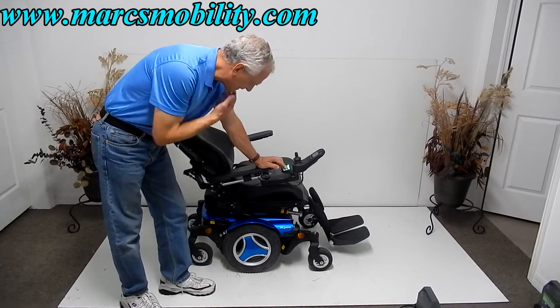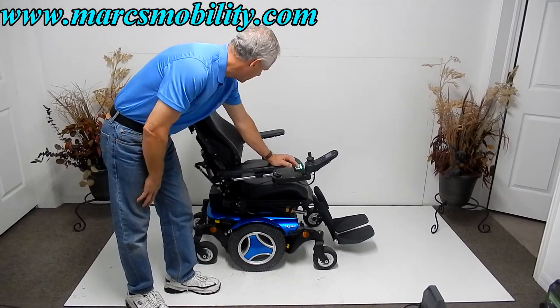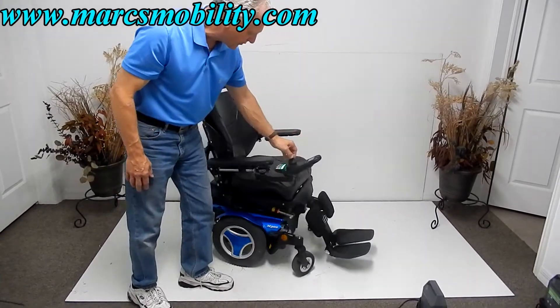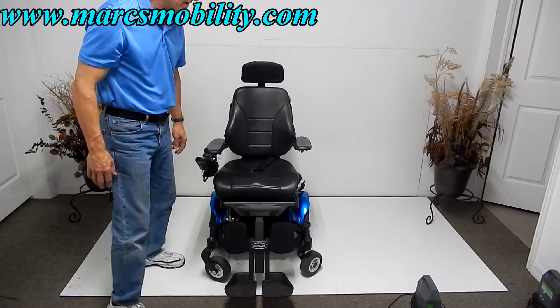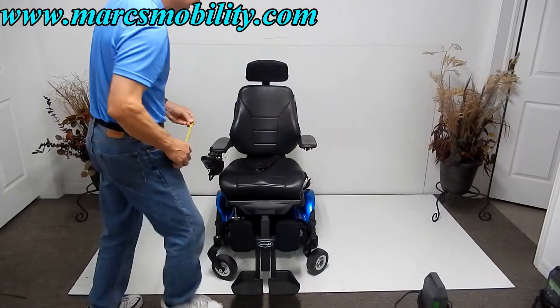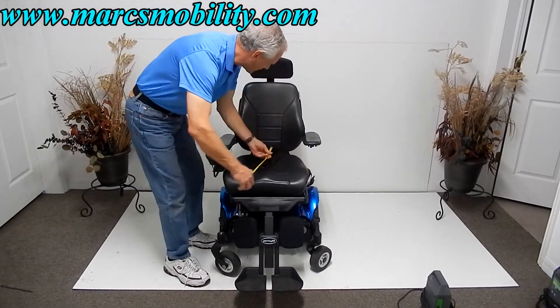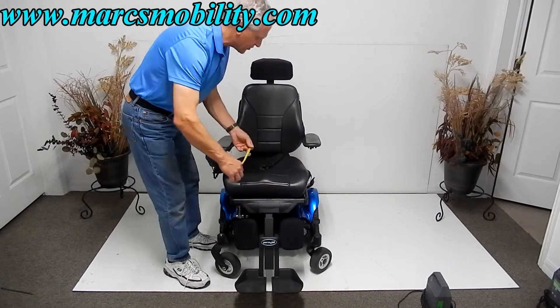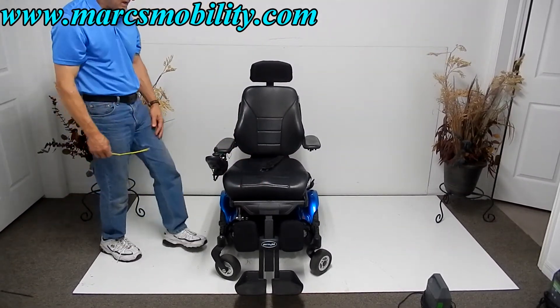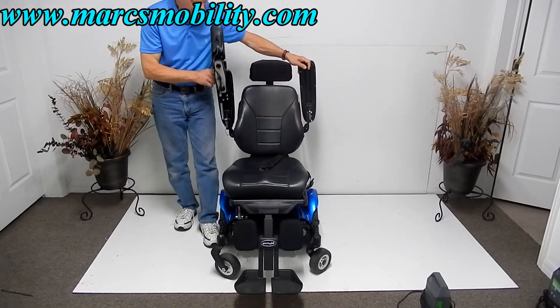The joystick is a swing-away joystick. The arms are adjustable up and down — we can adjust these arms. The seat is also adjustable on this chair. The seat right now is 19 inches wide by 16 inches deep, but we can adjust both the depth and the width of this seat. The arms are adjustable up and down for easy entrance.